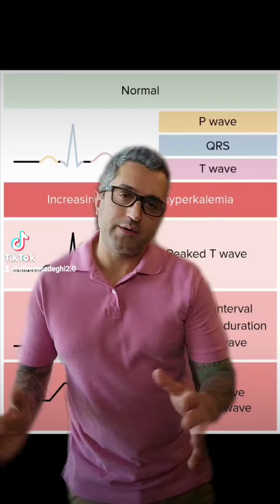EKG changes with electrolyte imbalance and thyroid disease. Let's go. We'll start with the easy one.